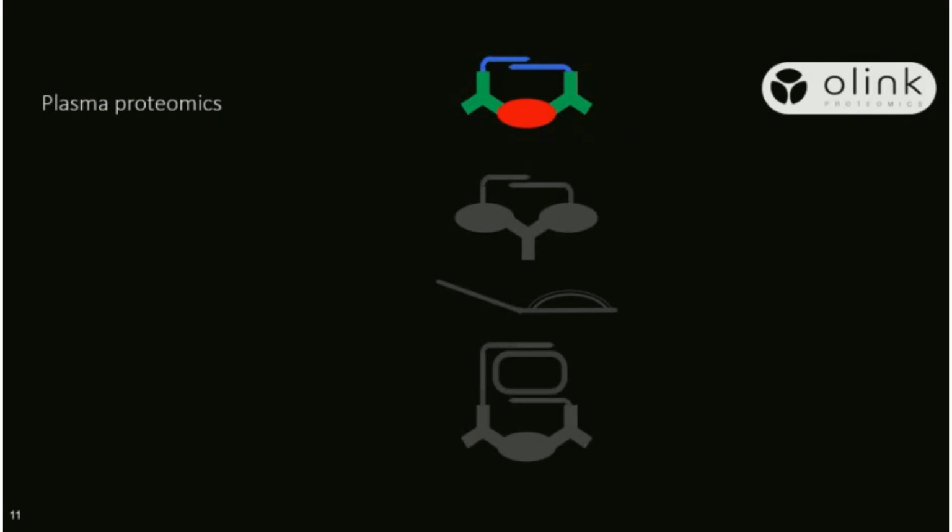Just one word, I think others will maybe talk more about Olink, but I believe most of you are very familiar with the Olink assay. It's two antibodies with conjugated oligonucleotides or antibody preparations. Often it's the same polyclonal antibody that's split in two. Sometimes it's monoclonal antibodies. And they can recognize the target.